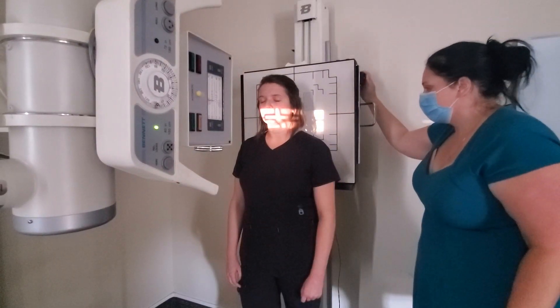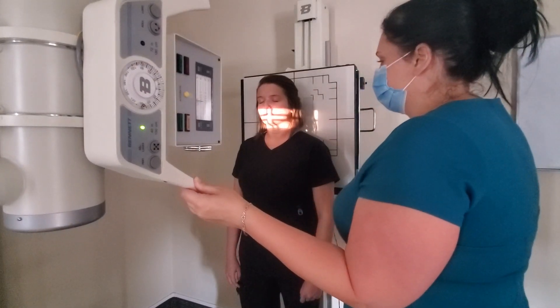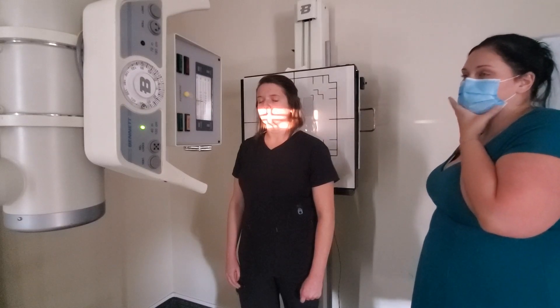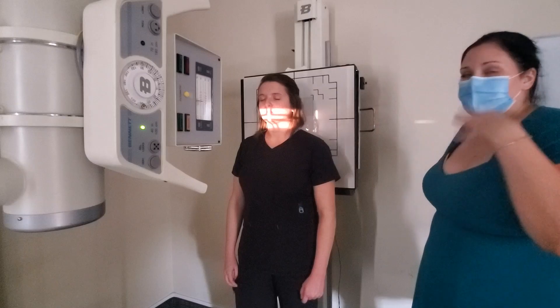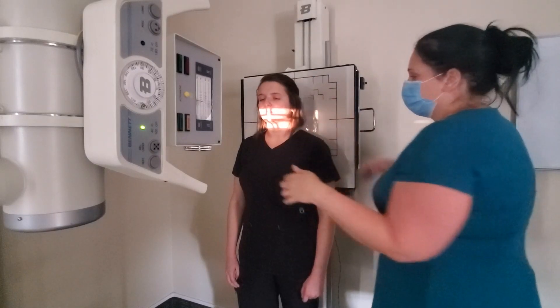I'm going to preemptively align to where I feel like this is going to end up because you don't want to have the patient's mouth open any longer than it needs to be — simply because it's very uncomfortable. A lot of patients have TMJ or other jaw dysfunction problems, and leaving that mouth open for extended periods of time is going to be very uncomfortable.